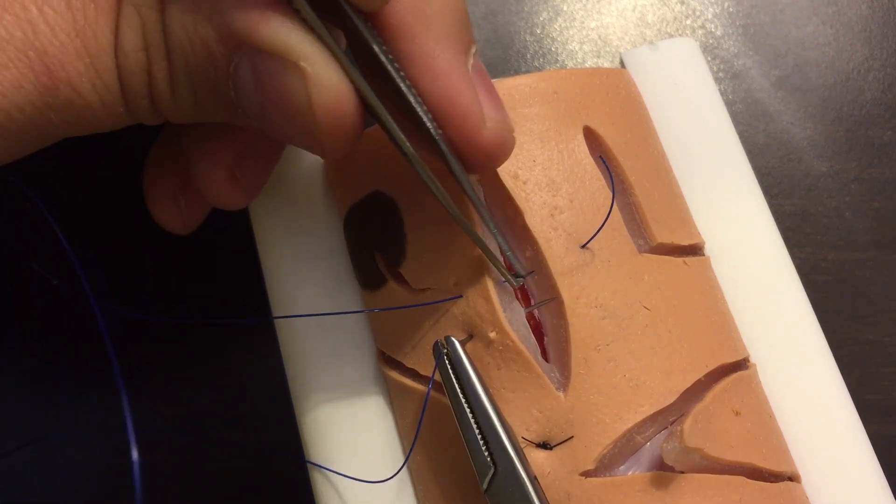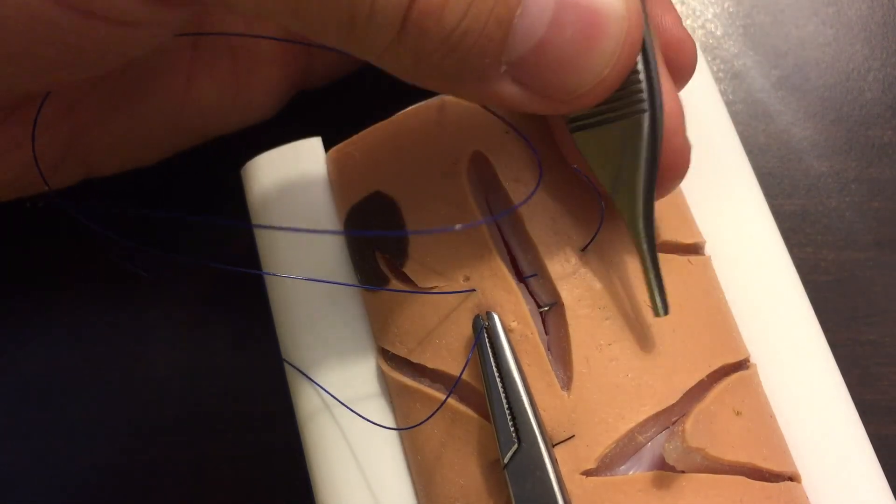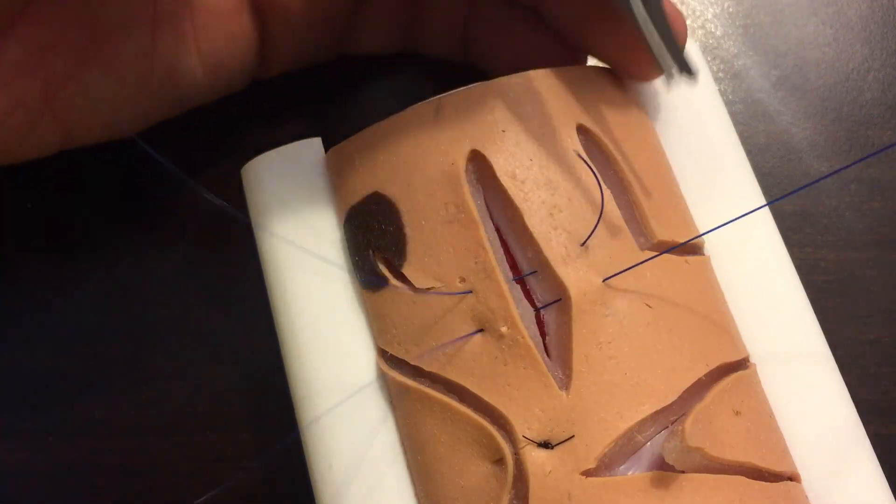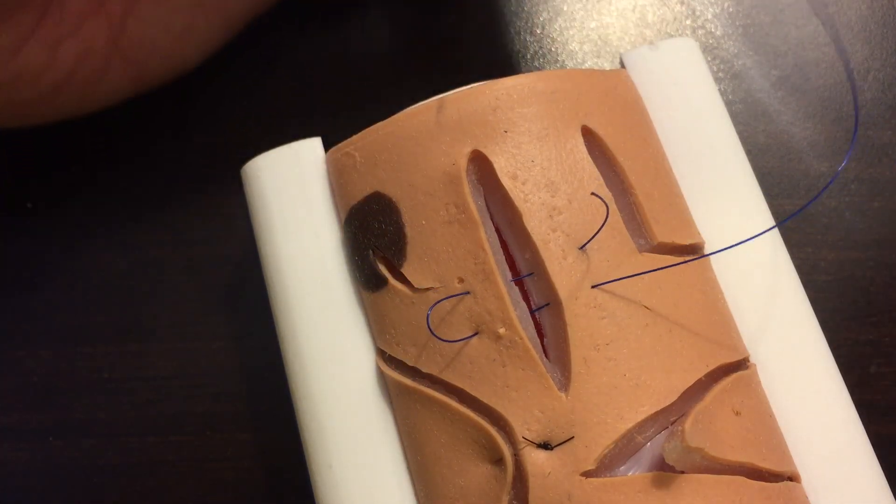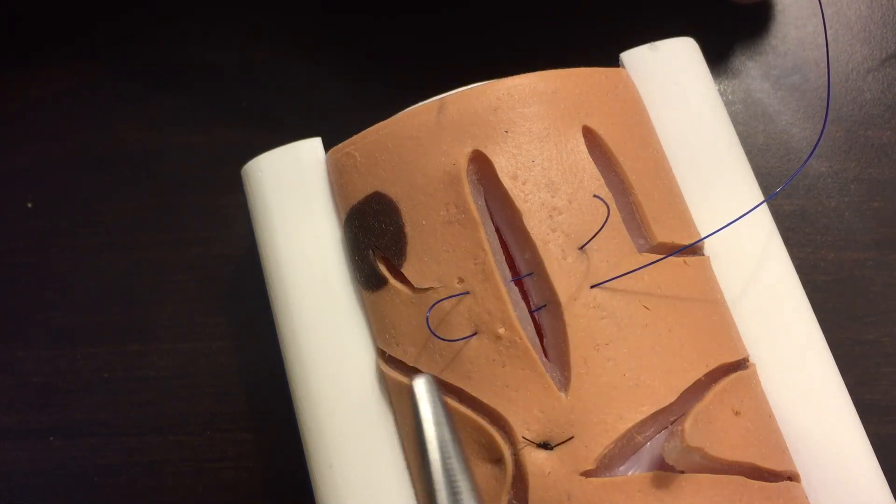We're going to make sure that our next pass is the same depth as our first pass. Then you're going to exit the skin at 90 degrees.